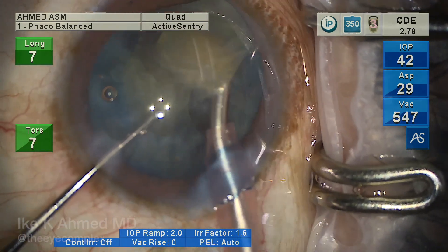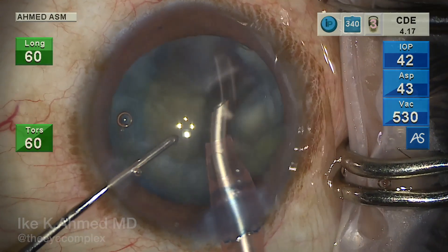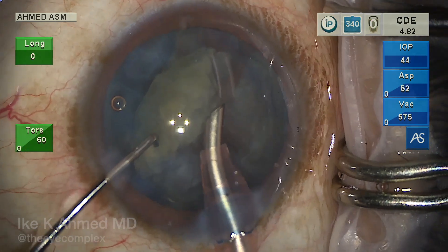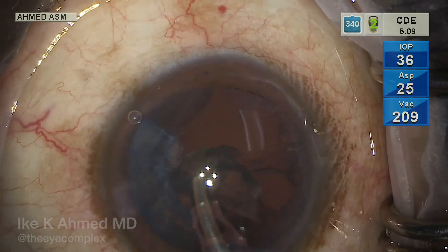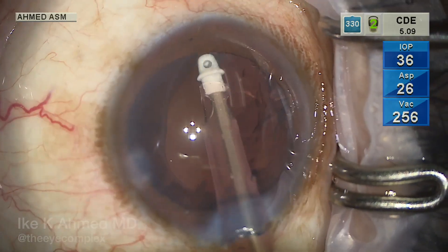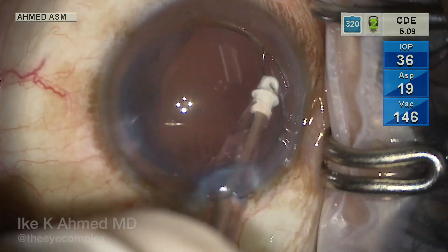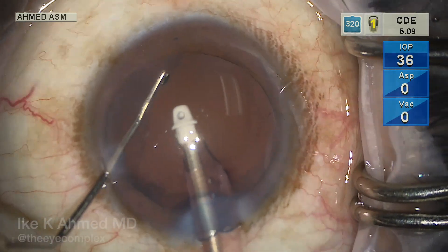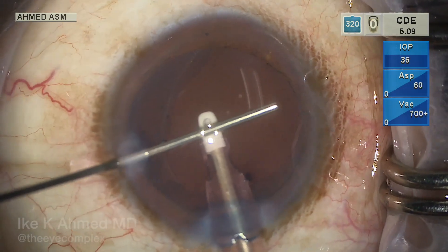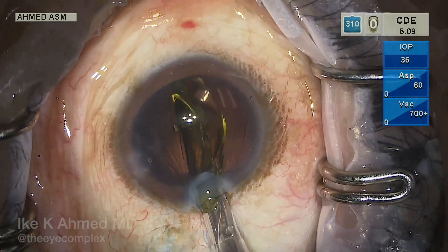One consideration in this case is that the patient requires a fairly large cylinder toric lens — a T7 lens to correct three diopters of corneal astigmatism, approximately five diopters of cylinder on this implant. During IA, the cortex is removed, and we can see how large this area is — about 90 degrees or more where the capsulorhexis has run out. This is concerning for IOL stability in the capsular bag, particularly a one-piece lens. The optic or haptic may prolapse out of the bag anteriorly, rotate, sublux anteriorly, or cause UGH syndrome.